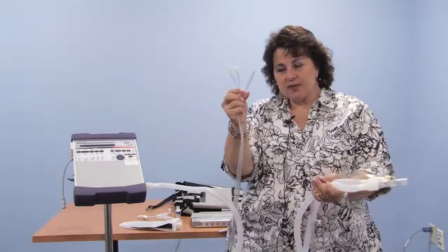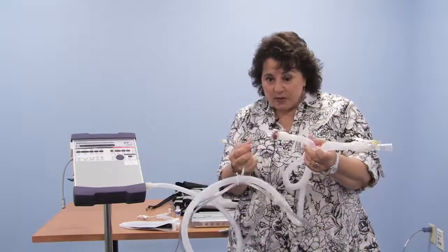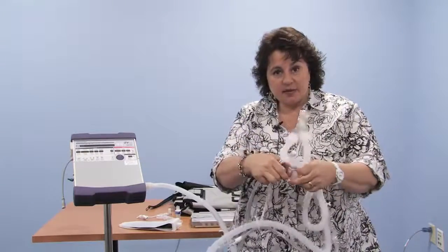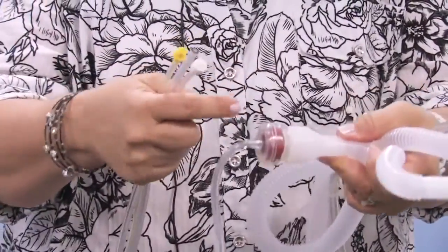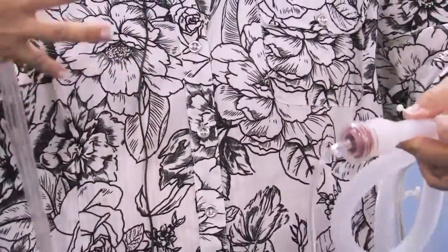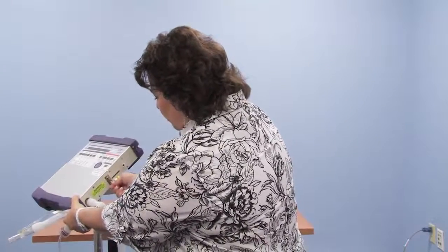We have our 3 hoses. The straight cutoff hose, if we follow it, goes to where your child exhales. You'll see that that looks a little bit different than the other one. It does not have the PEEP valve incorporated into it. So it's still an exhale valve. It will still have moisture if it were on a wet circuit, but your child exhales here and the machine will send a signal so that this red rubber valve will either stop the air from coming out so that it inflates the lungs during the time it's told to, and then release. And this connection to the machine tells it what to do. We're going to connect this to where it says EXH valve and make sure it's secure.